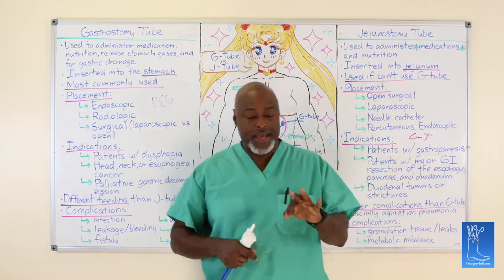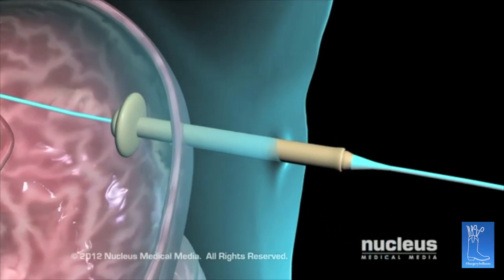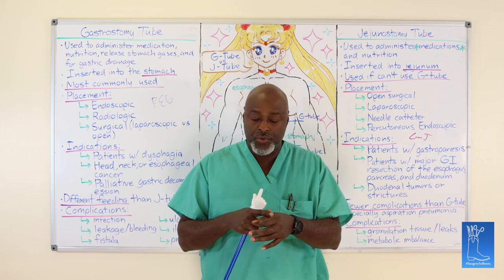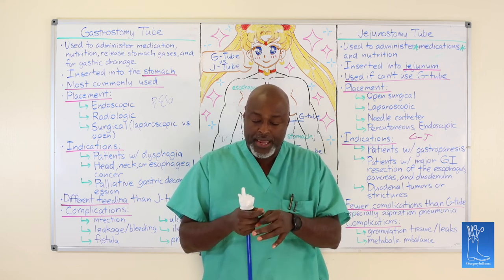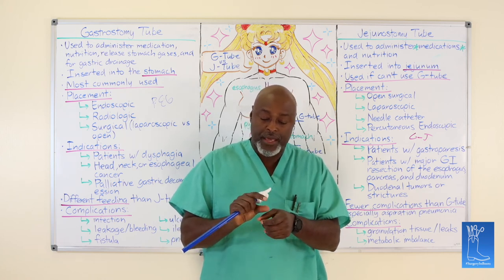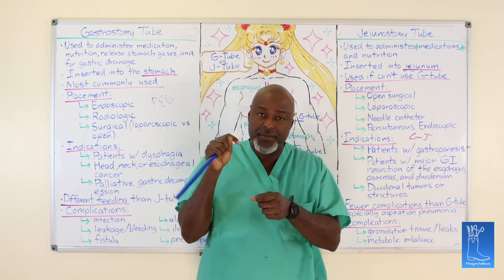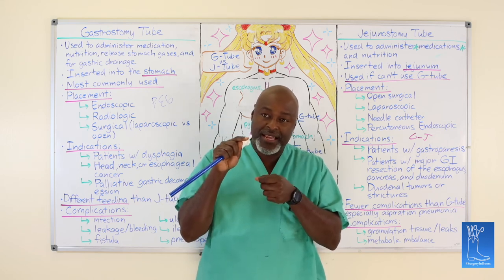So the G-tube has a little bolster on the end of it. It's a little solid donut. They also make them with a balloon that you can blow up pretty big. With the ones that don't require a balloon, if that donut on the end is pulled just enough or it erodes and their nutrition is bad, it'll sit between the skin and the stomach. Sometimes you'll have a fistula into the stomach, so they can still get tube feedings in, but some of it will come out. In that case, they get infected.